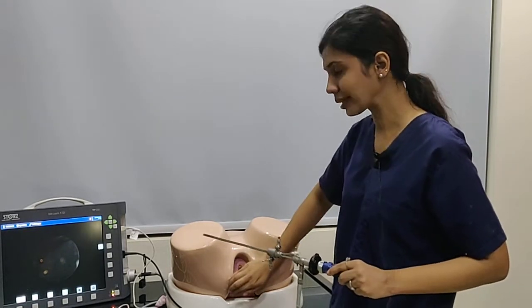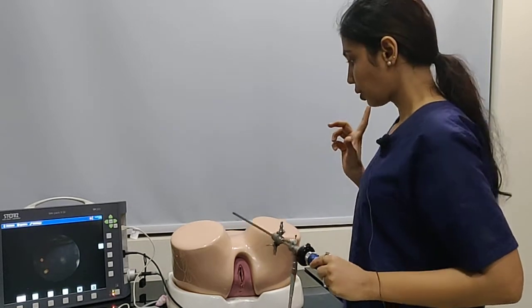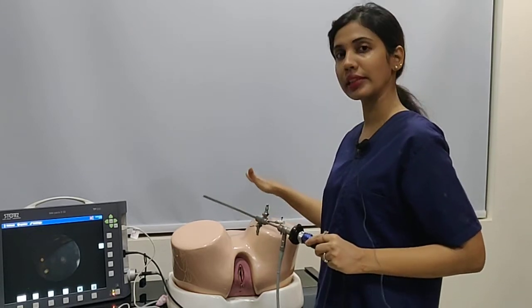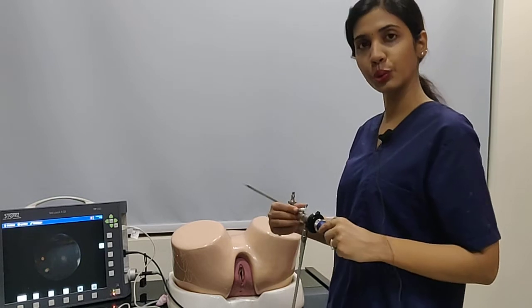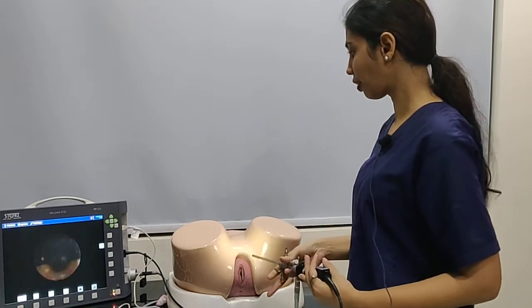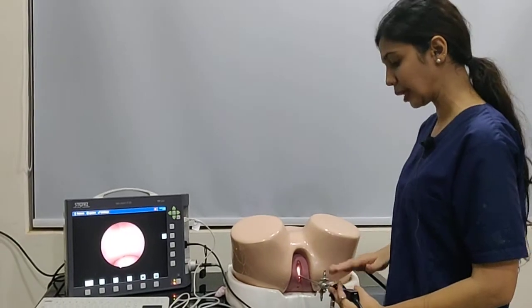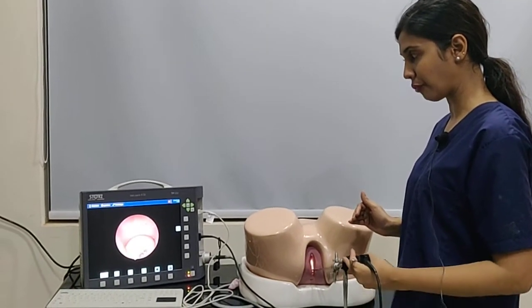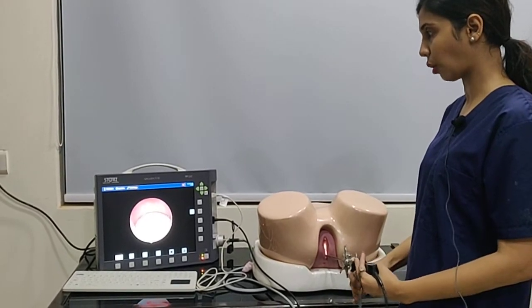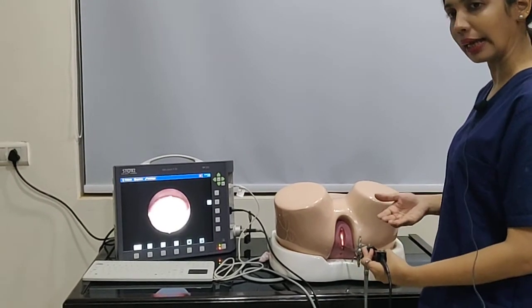Keeping in mind, we do not close the vulva like this, so that it is an absolute no-touch technique. This is an anteverted uterus, as we know from our previous examination. For an anteverted uterus, when we are going inside, we have to keep our hands above so that we can visualize the external os. We can see the external os by simply moving our hand upwards.